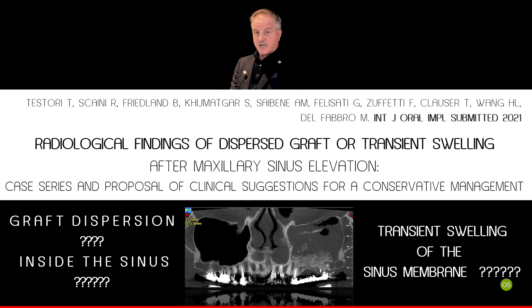Is it a sinusitis? You see this case. Is it a sinusitis? You cannot tell that, because if you want to do surgery on a predictable base, you should be thinking like a medical doctor.